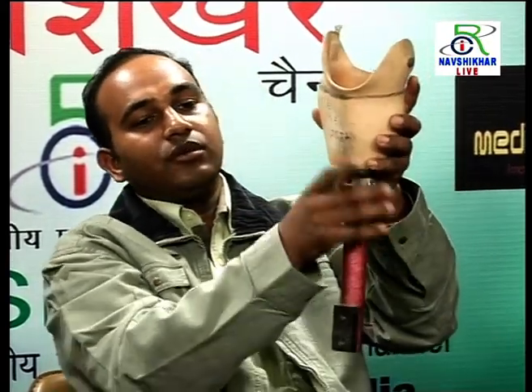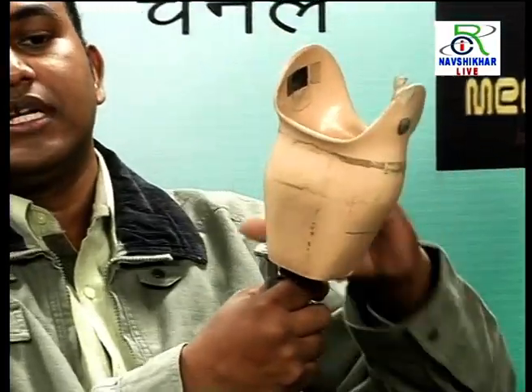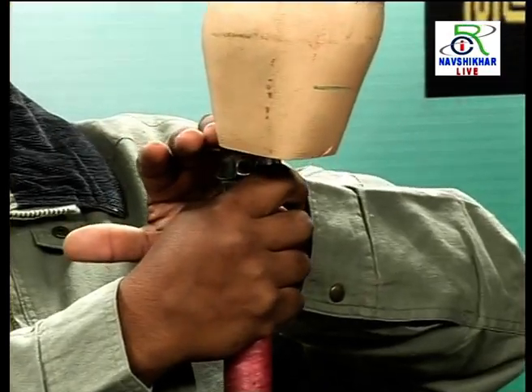In most prosthetic systems, the socket is changed due to frequent use. Like a child, if he is using the prosthesis and grows up, the socket has to be changed. So every time you just remove the socket, this part can be removed and changed. You just take another cast and make the socket.